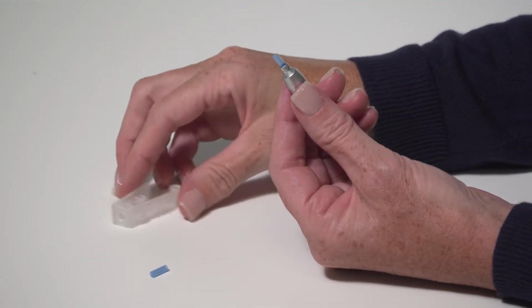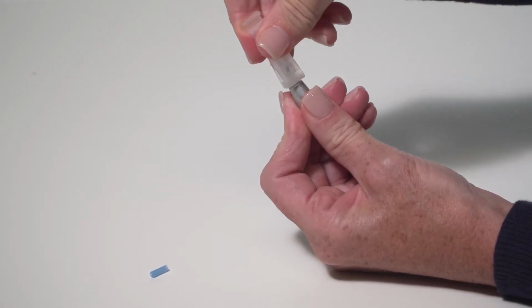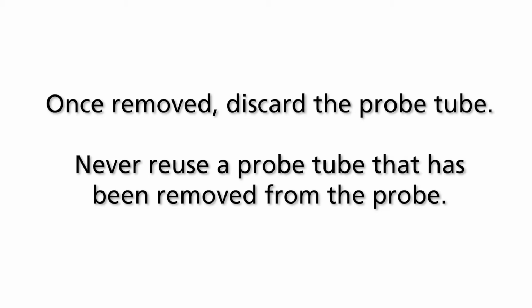If there is an obstruction or damage, remove the probe tube. Take the removal tool and place over the end of the probe. The probe should be seated against the face of the tool. Squeeze the tool to clamp. Twist the tool a couple of times while holding closed and pull away from the probe. Once removed, discard the probe tube. Never reuse a probe tube that has been removed from the probe.